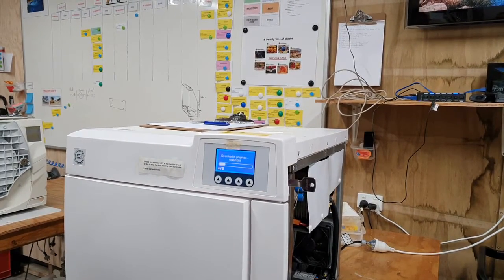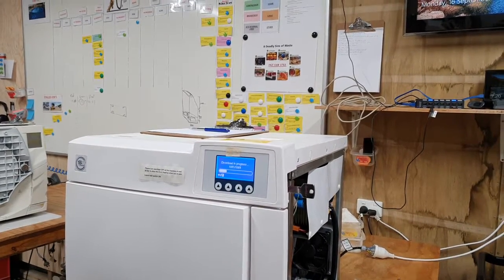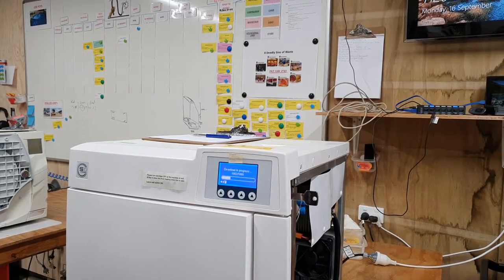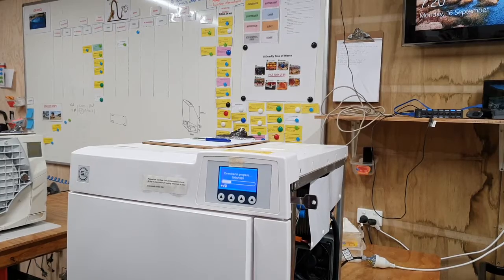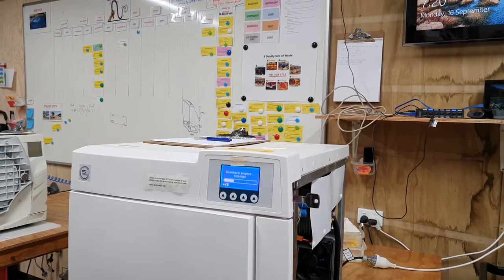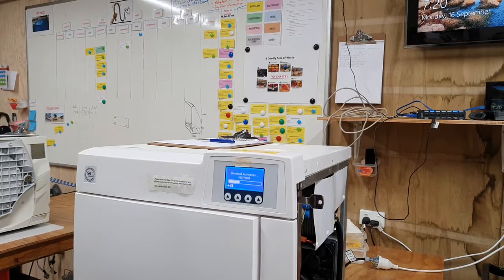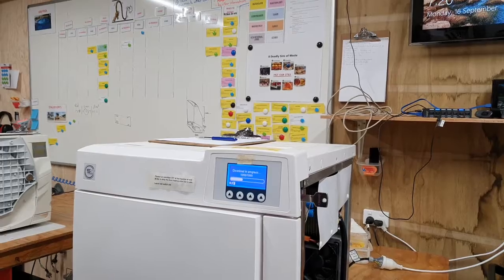The machine has an internal memory and knows when you last downloaded the cycles and only gives them the new ones. So if we downloaded the new ones, when the client goes back and downloads them again, it'll only get it from the point that we've downloaded, so they'll lose that information. So yes, in our workshop, we need to use either the last 10, 50 or 100. That takes a little bit of time.